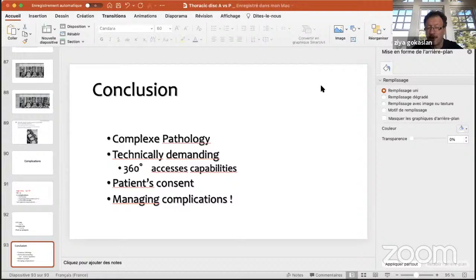hemicorpectomy: above, most of the vertebra, all the way close to the disc space; below, I see the PLL above and below, a normal PLL, not the disc. So that's where I find the dura laterally, and then go above and below, find the PLL, and peel the thing off, and not at the disc level. I've seen many times people drilling into the disc, and the next thing you find yourself in the spinal cord. So I treat these cases as if it's a tumor: I'm above it, I'm below it, I'm lateral to it, and then pull the whole thing away from the cord.